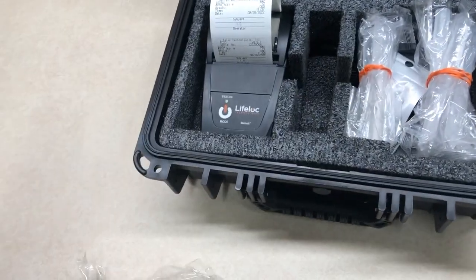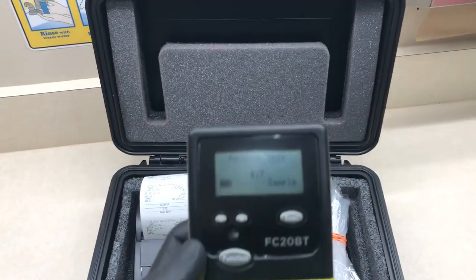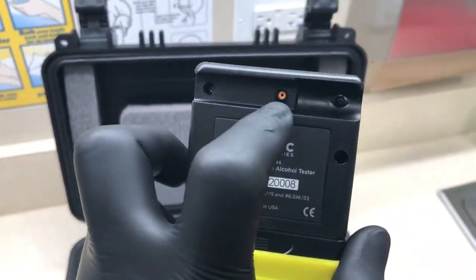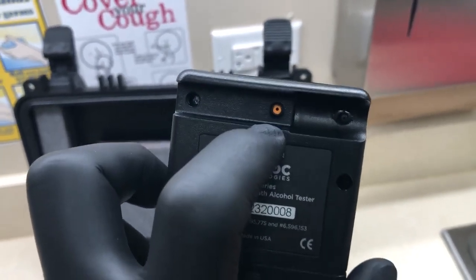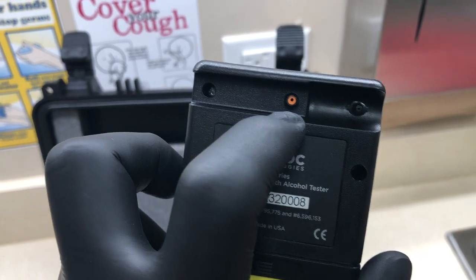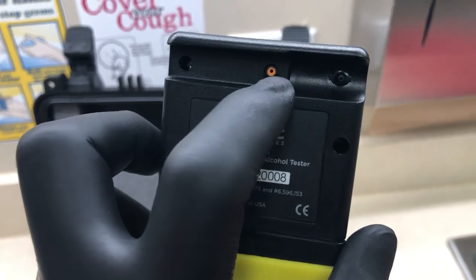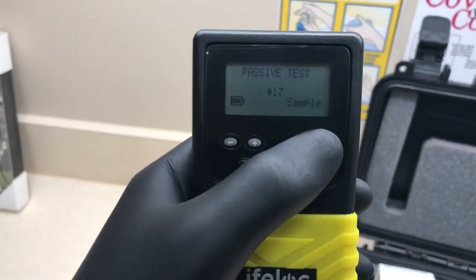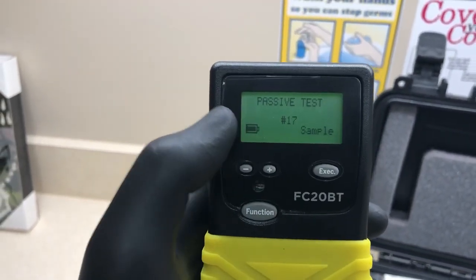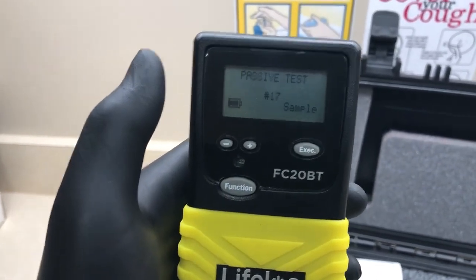The passive test, you don't need the straw. All you're going to be doing is using the back side of this. You're going to be holding it 4 inches away from their mouth when they just let a breath out, or let some air out, or exhale. This is the port, so this is what you're going to be testing with. Whenever they exhale or just breathe out, you're just going to press that sample button. All it is going to tell you is if they're negative or positive for alcohol, or negative or positive for ETOH.